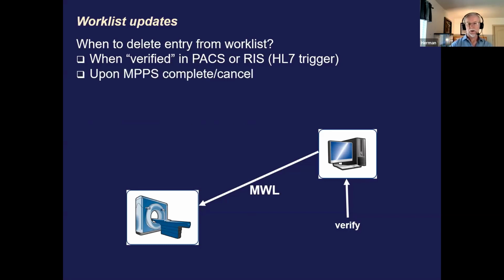Sometimes some hospitals, and actually far too few in my opinion, use MPPS, Modality Performed Procedure Step, because I can guarantee you 99% of every modality has it, you only need to switch it on. If you switch it on, as soon as the technologist completes the study, it will automatically be notified, right? So then the modality worklist provider can automatically take it off the list without the extra step, because sometimes the technologist might forget about it. So MPPS complete, cancel.